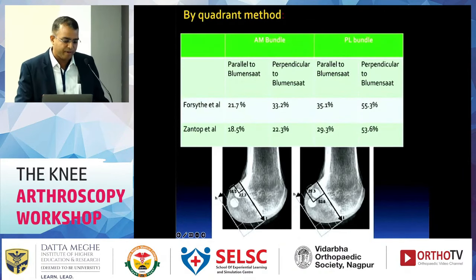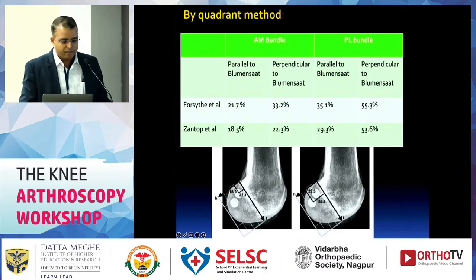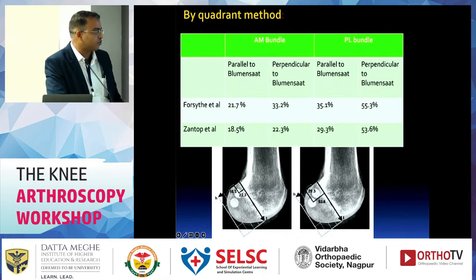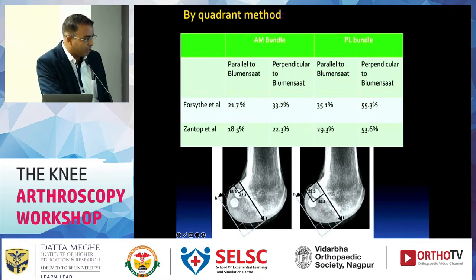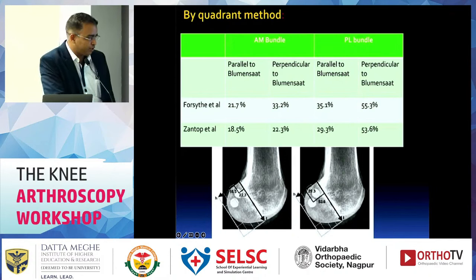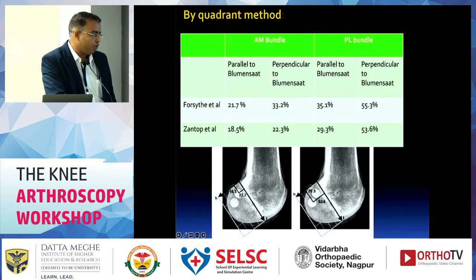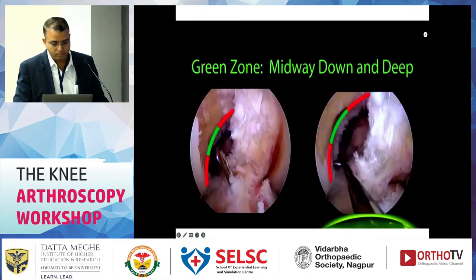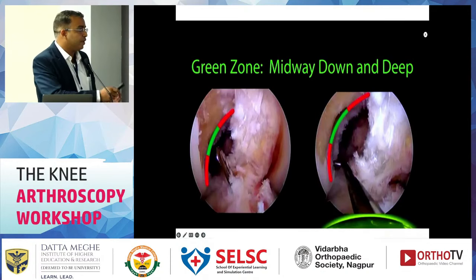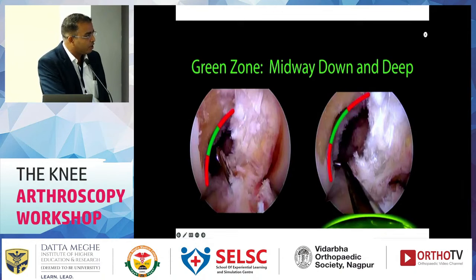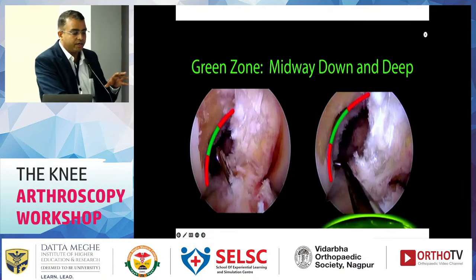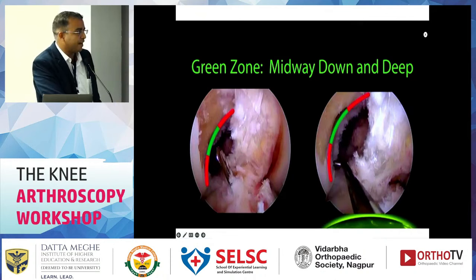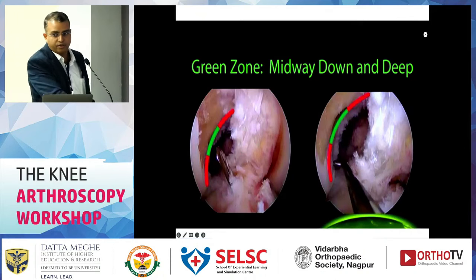The quadrant method measures from deep to shallow and from high to low. When viewing from your lateral portal, remember: you should not place the tunnel in the red zone — the green area is the appropriate zone for making your tunnels.